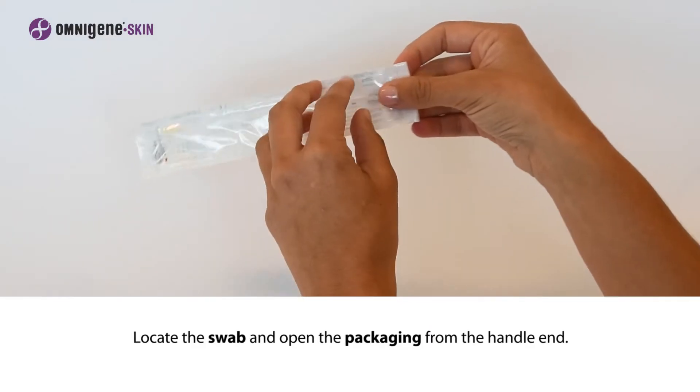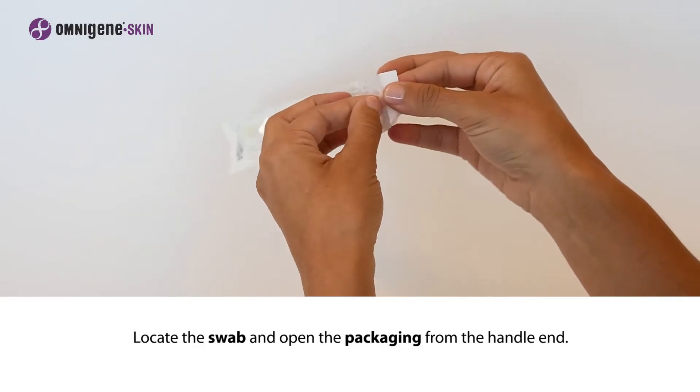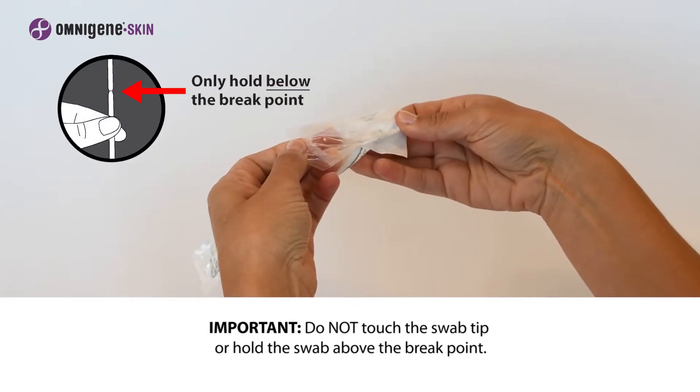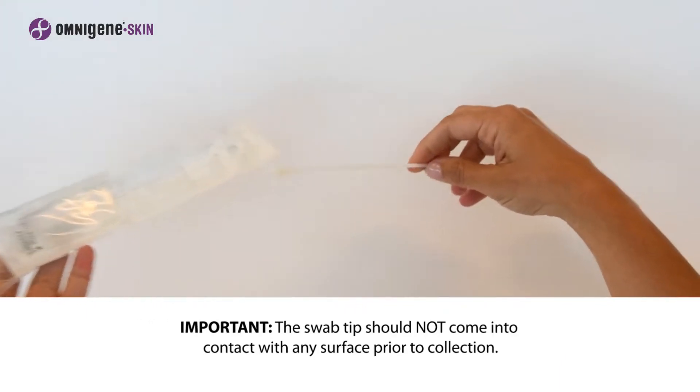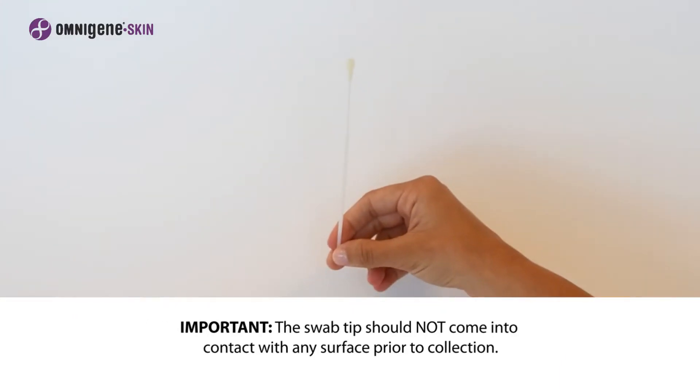Locate the swab and open the packaging from the handle end. Important: do not touch the swab tip or hold the swab above the break point. Ensure the swab tip does not come into contact with any surface prior to collection.